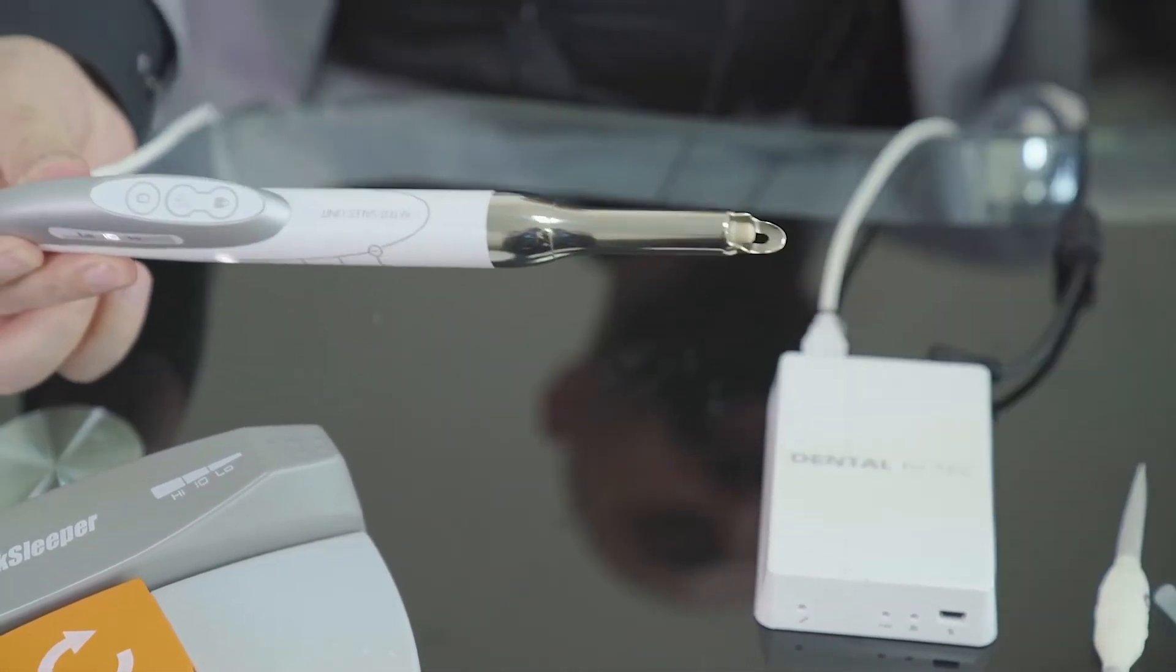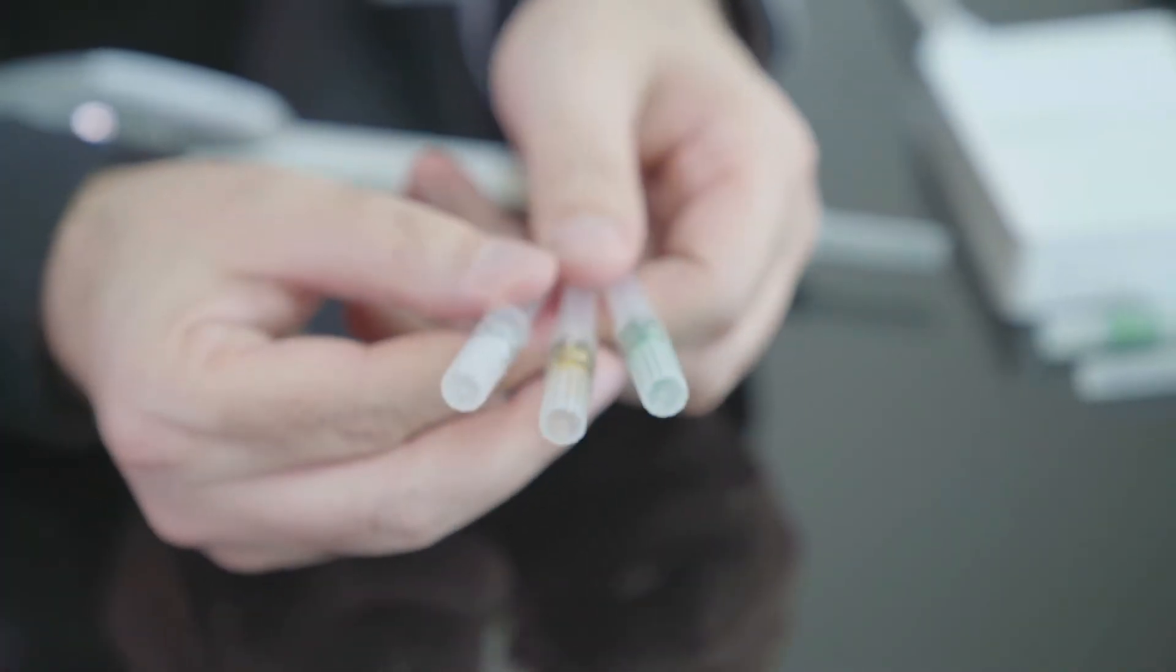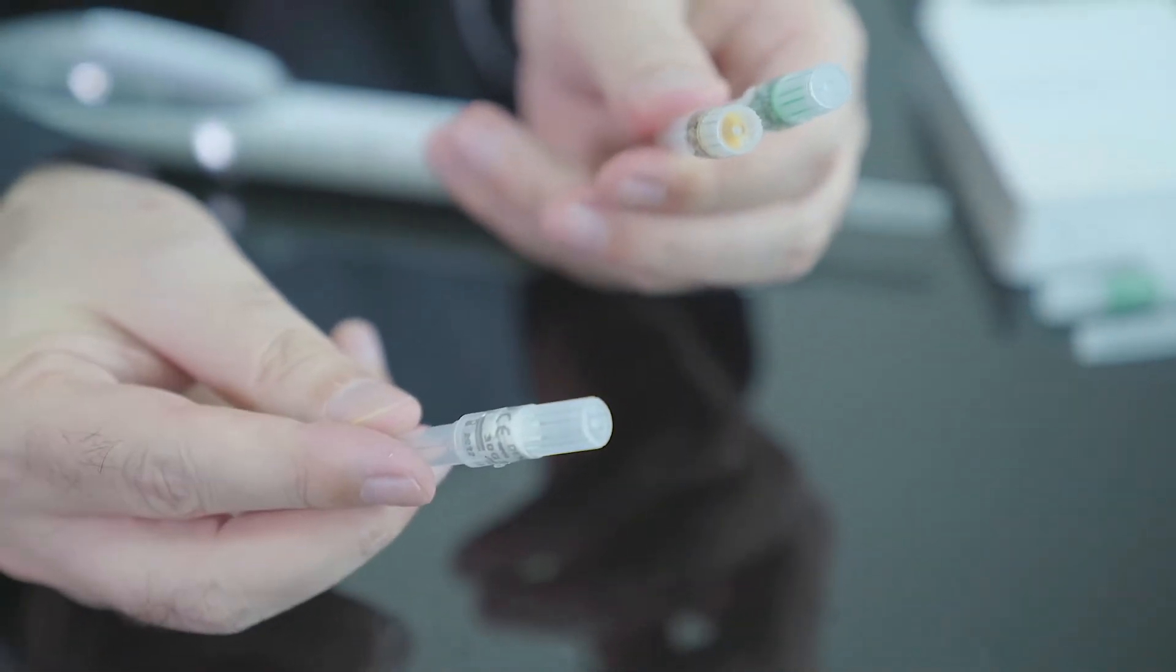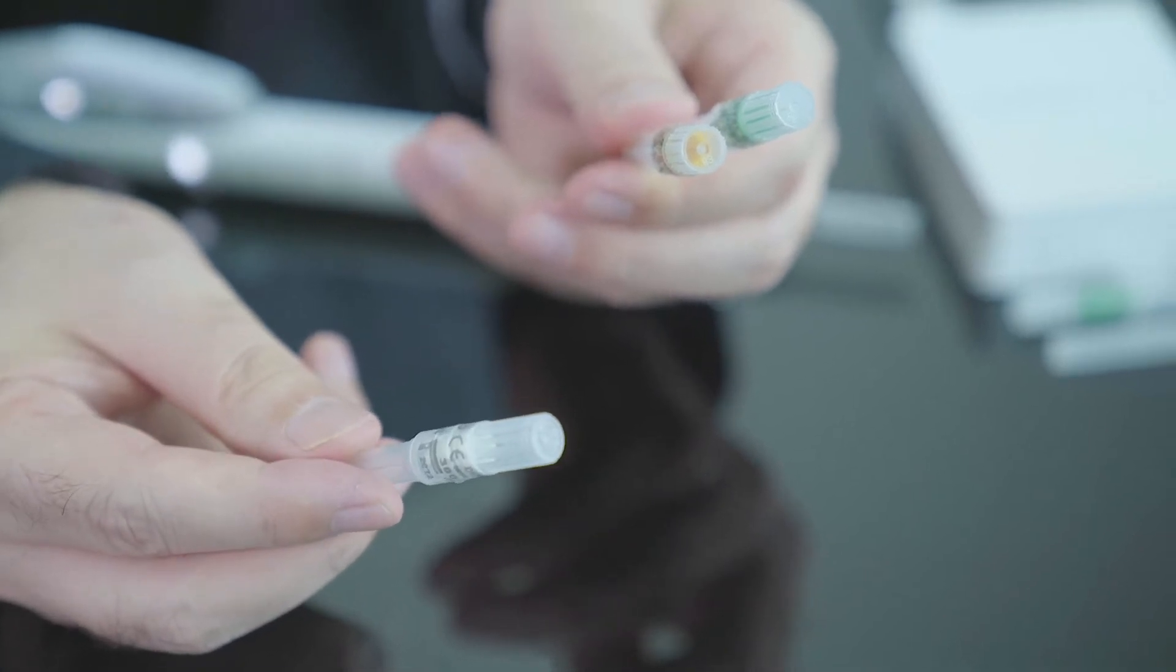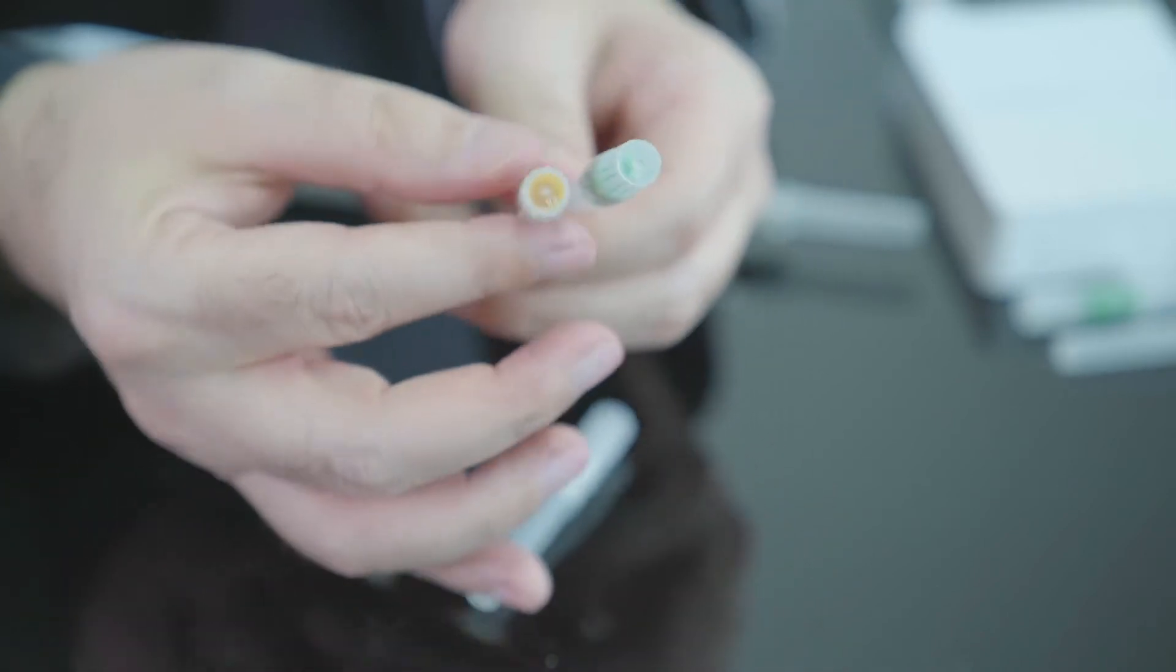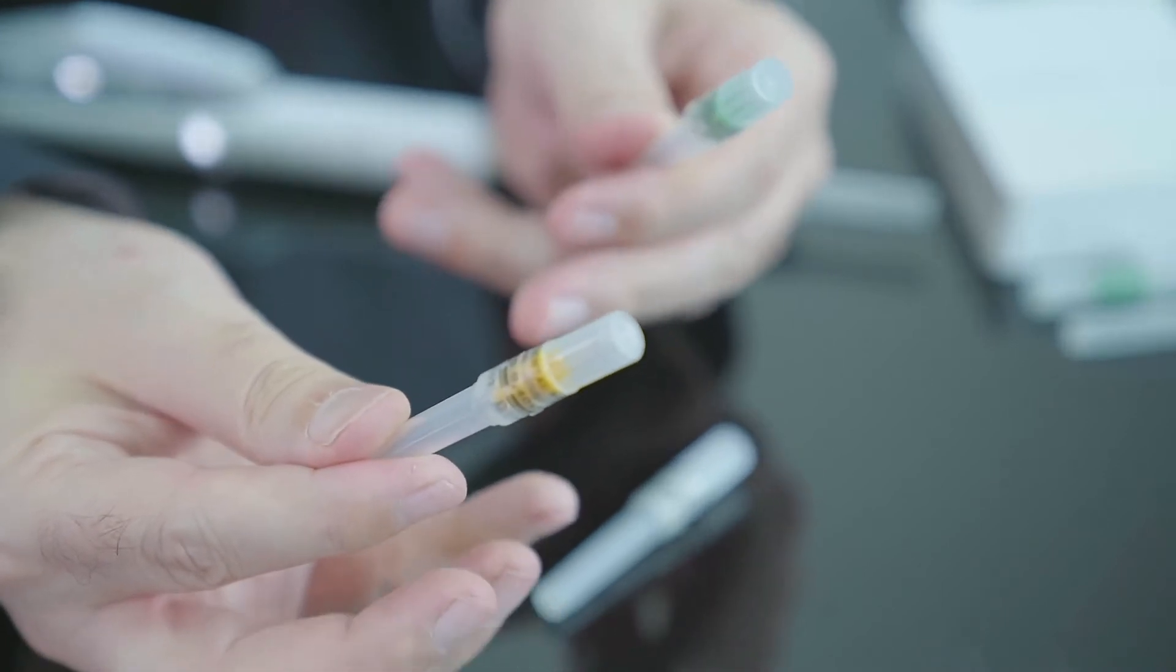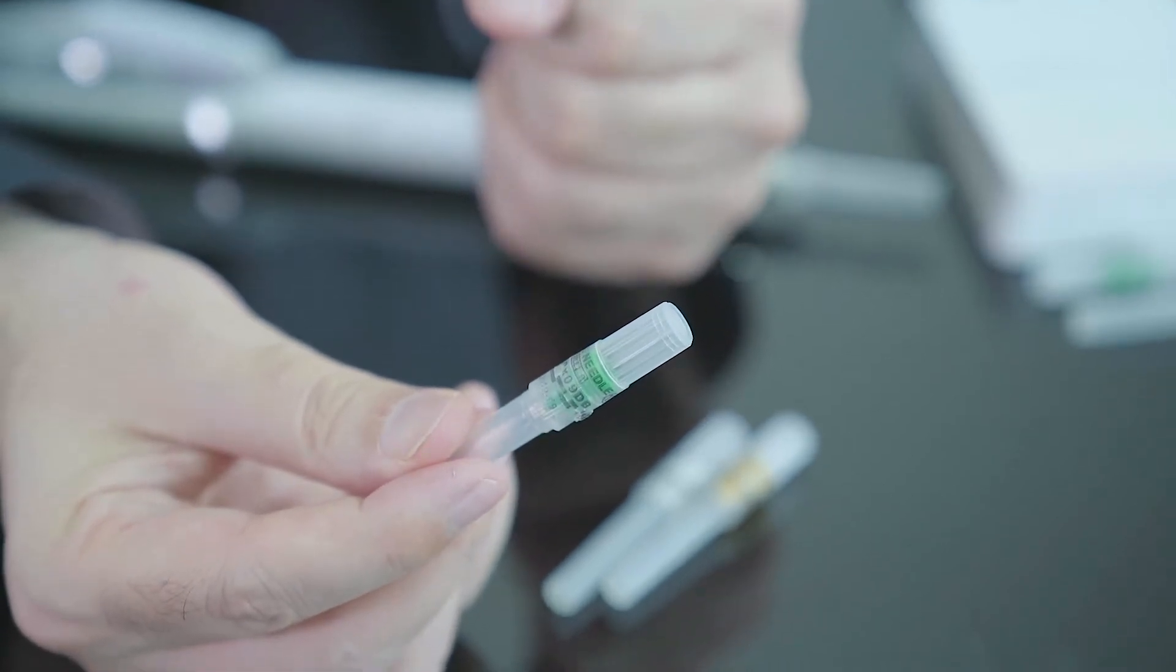Once it's done, now I will fix my needle over the handpiece. By the way, needles have three colors. The white one is the normal one, to do all anesthesia techniques plus intraosseous in the soft bone. The yellow one is a little thicker for doing intraosseous in the dense bone, mainly in the mandible, in the lower jaw. And the green one is used mainly for children.